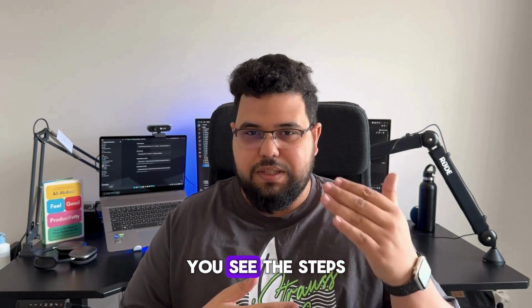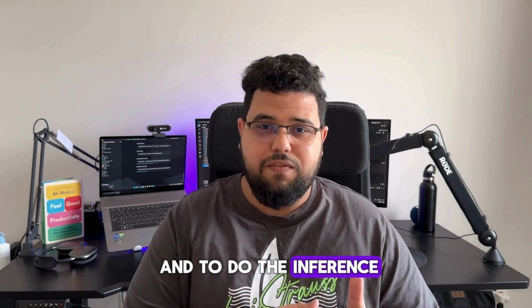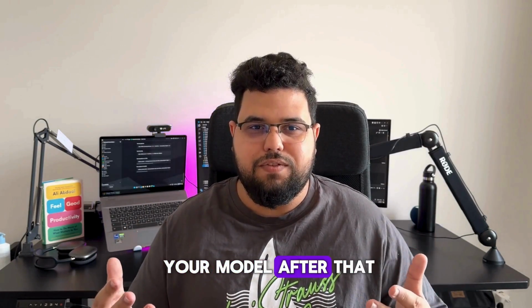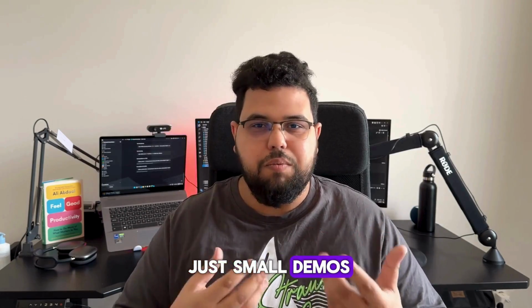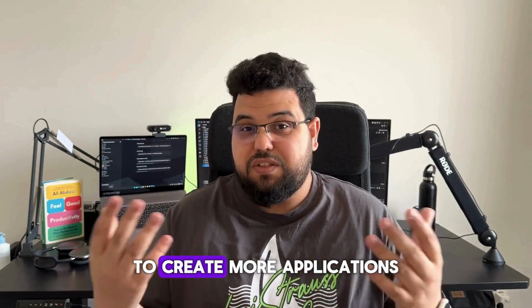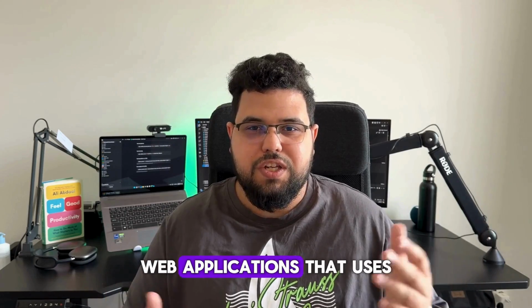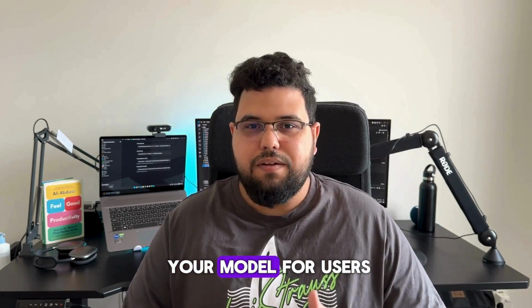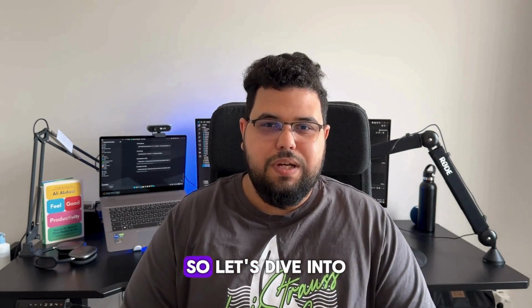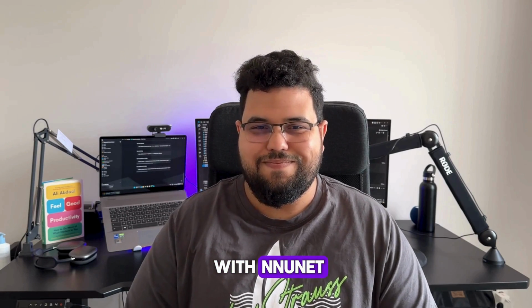In this video, you'll see the steps that are required to do the training and to do the inference. And at the end of the video, I will show you how you can use your model after that. It will be just small demos where you can deploy your model to create small desktop or web applications that use your model for users, especially for MVPs. So let's dive into the video and see what we can do with nnUNet.